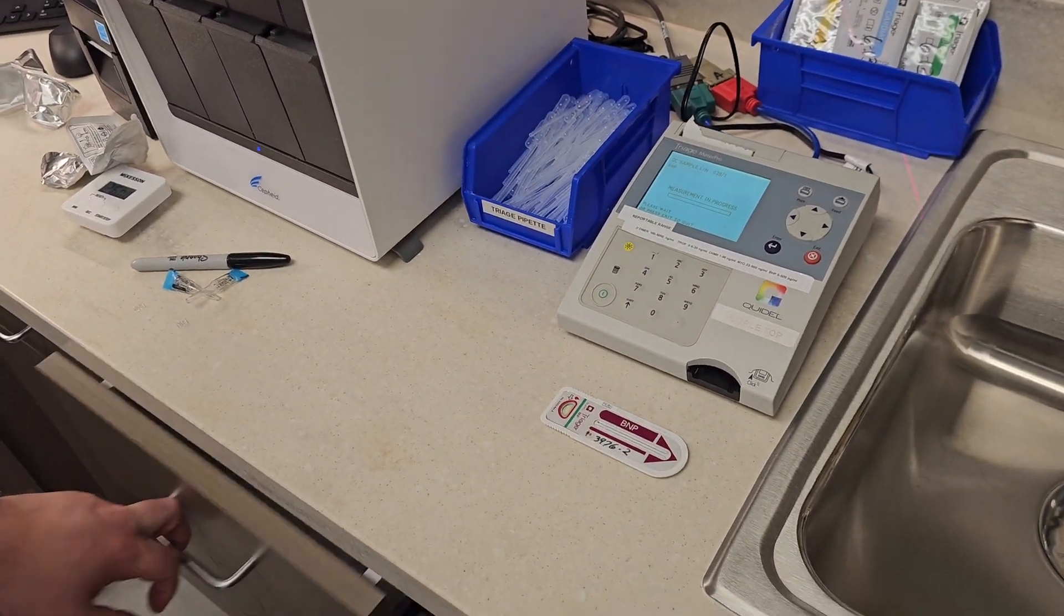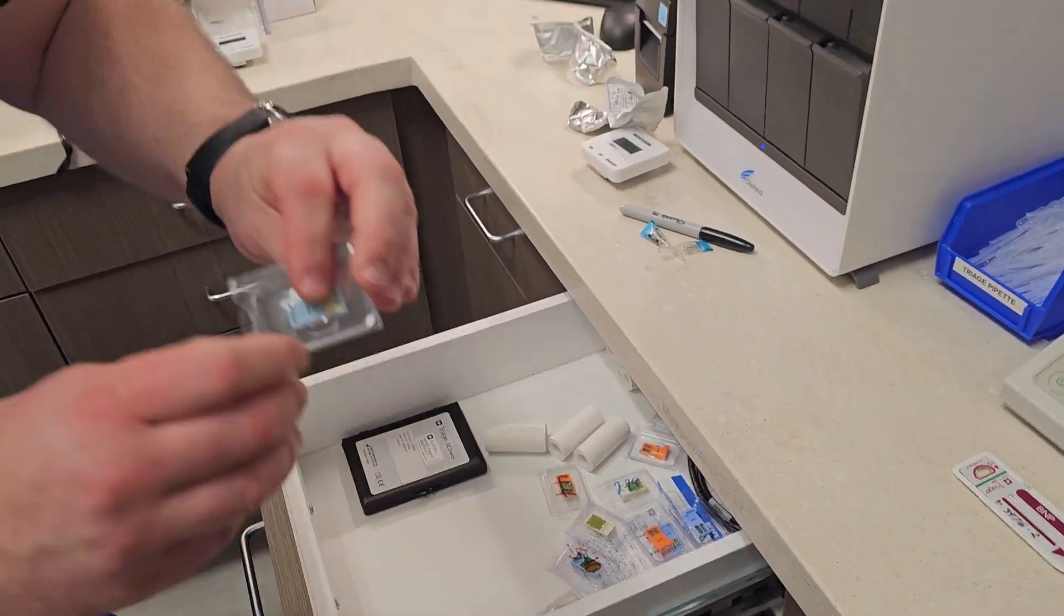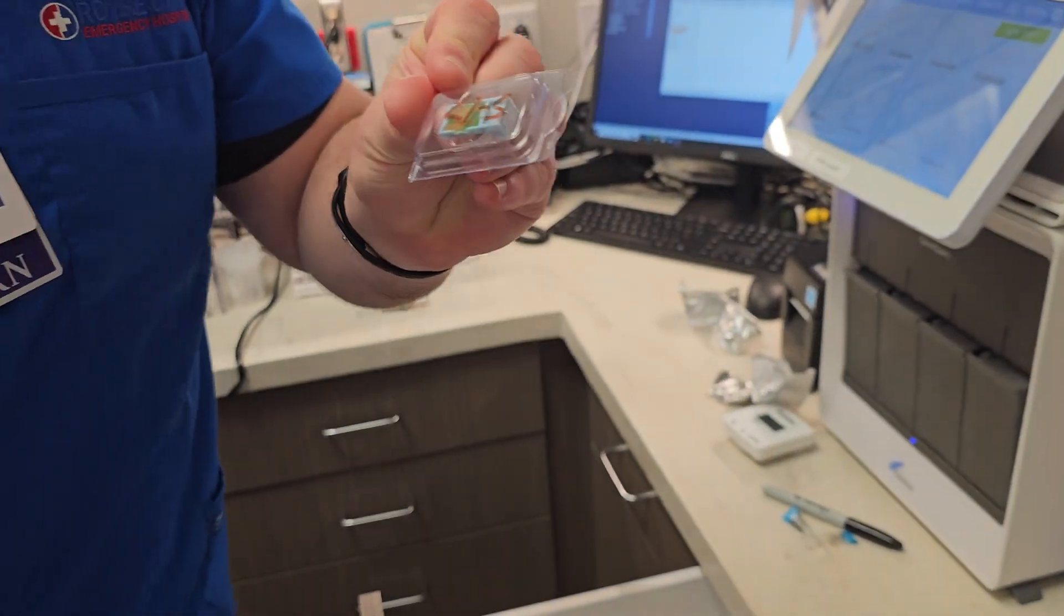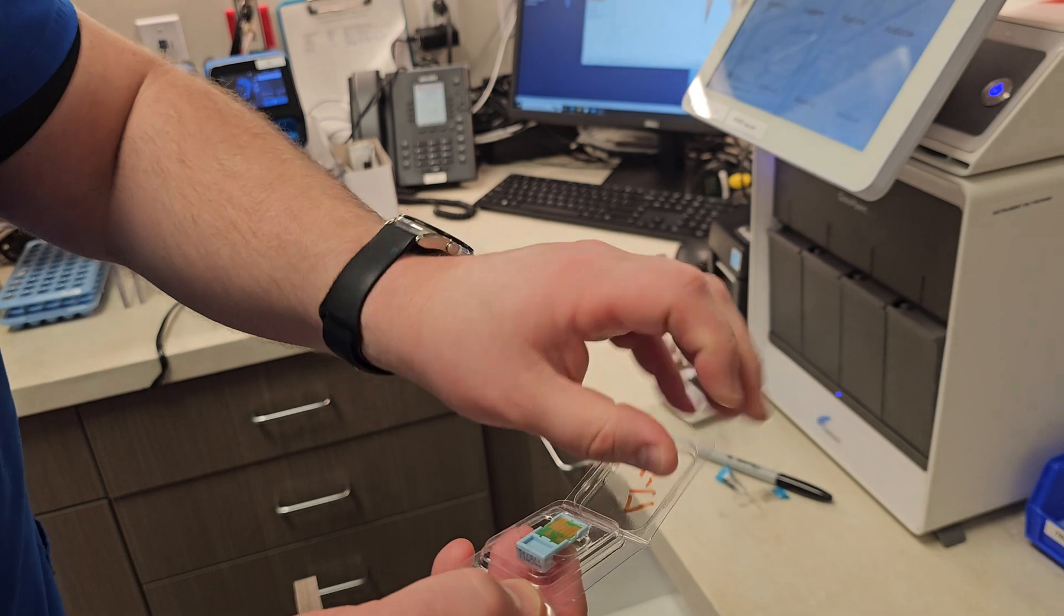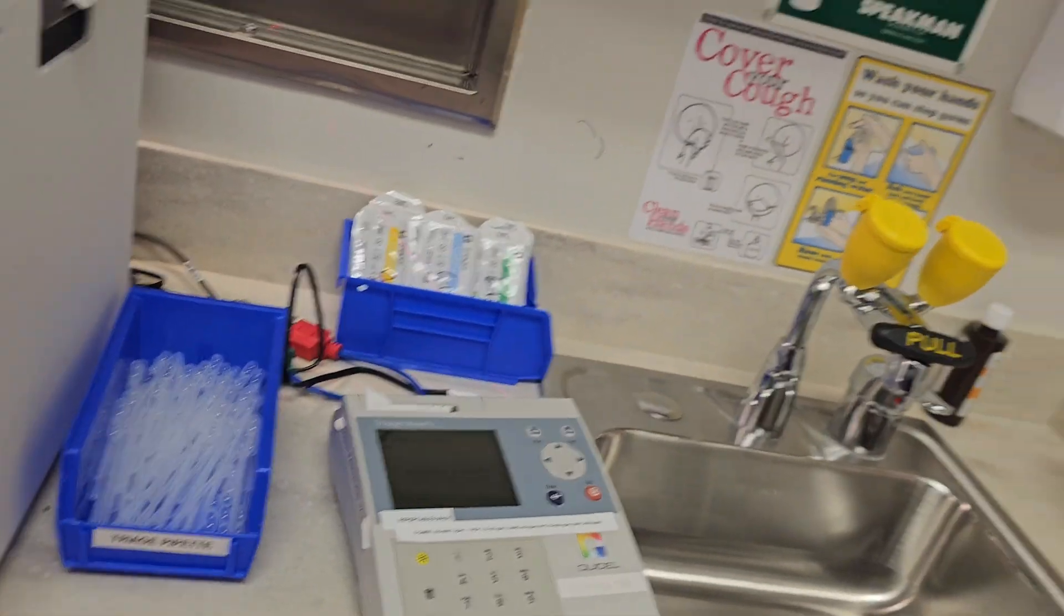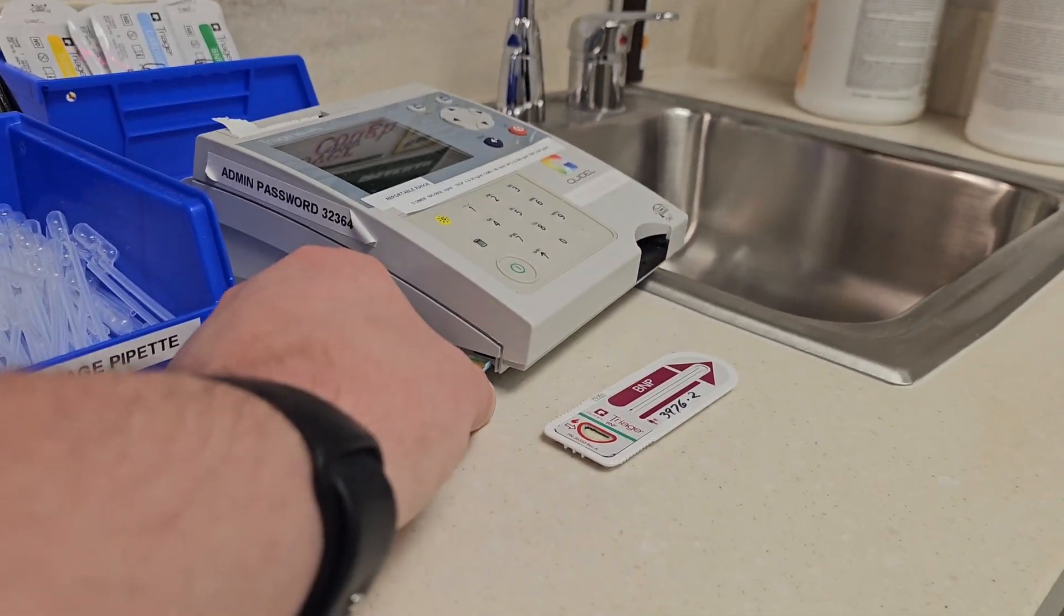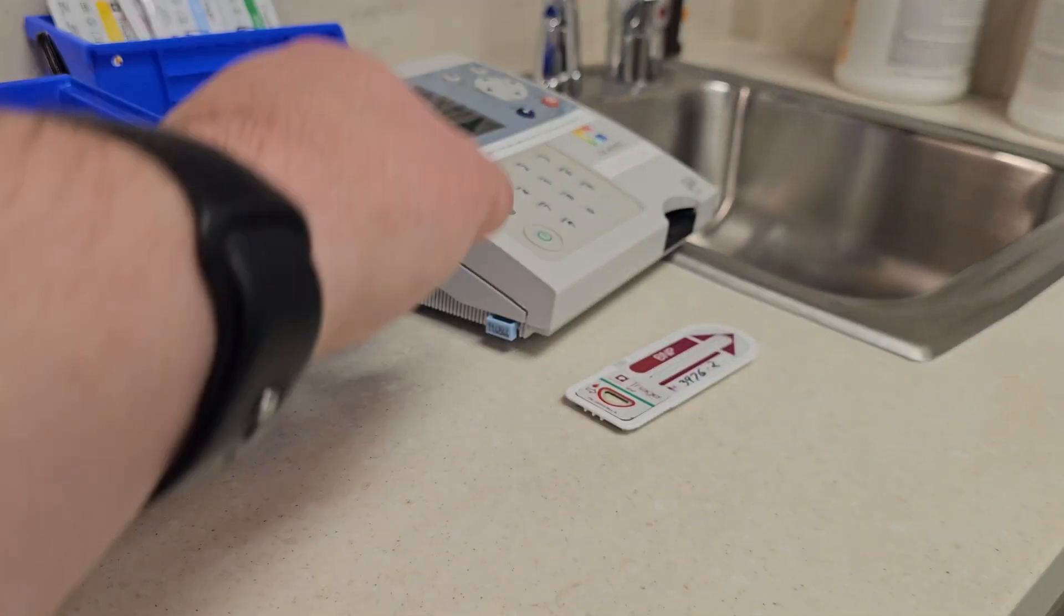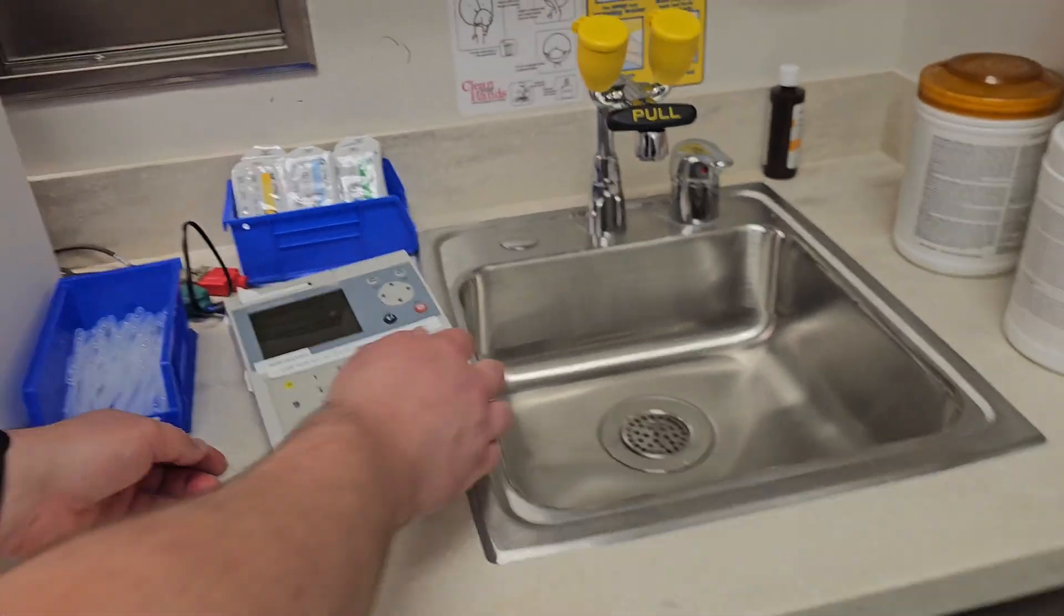That code chip looks like this and it comes inside the box. If the machine asks you to install the code chip, you're just going to move your analyzer to the side over here. There's a little space down there where that code chip goes. You'll insert it and then hit enter on the analyzer.